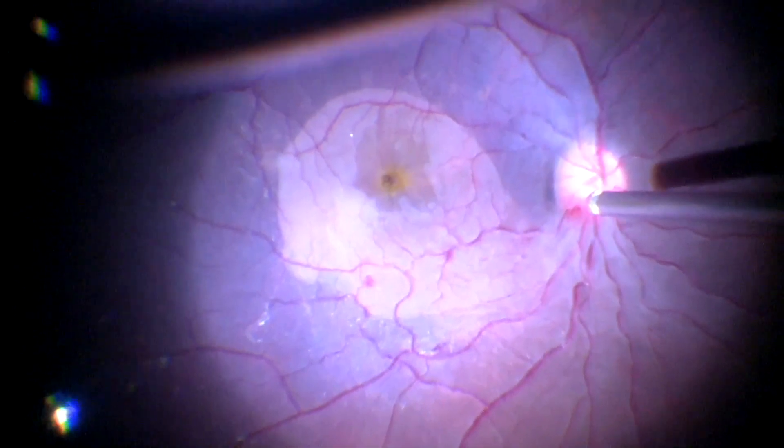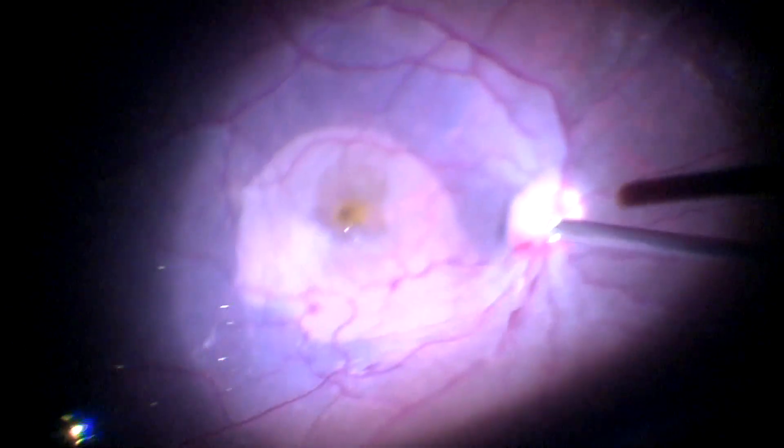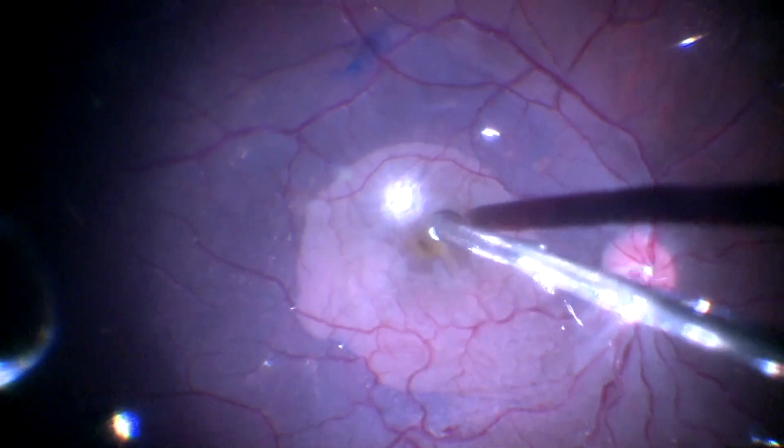After this, an air fluid exchange is carried out. By the end of the exchange, we can see the hole reducing to a pin point.